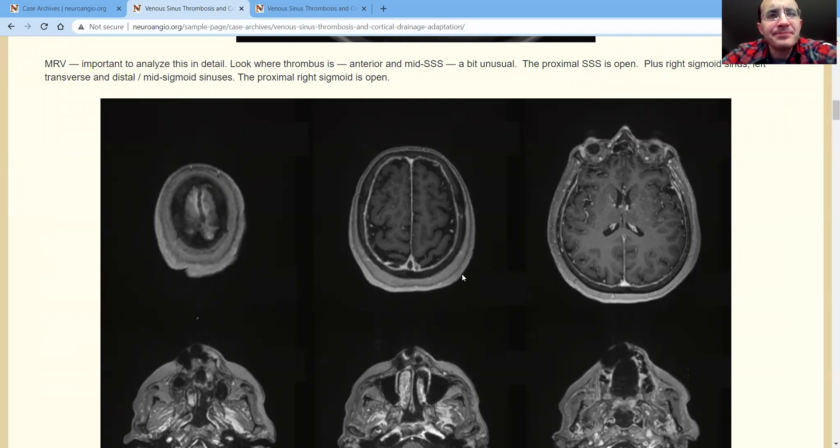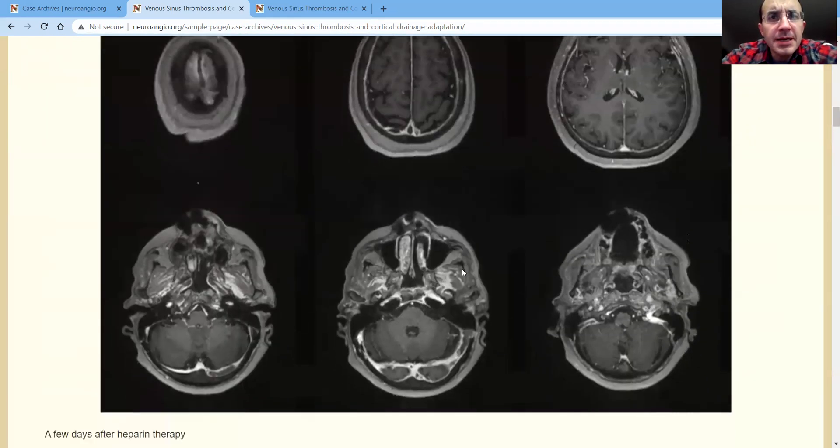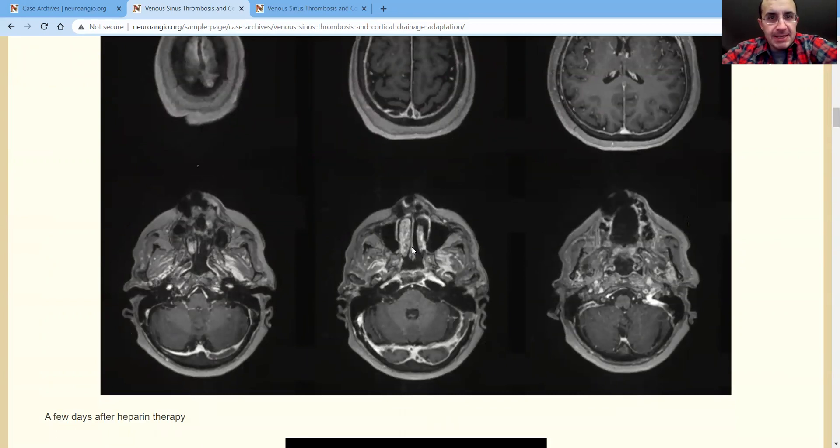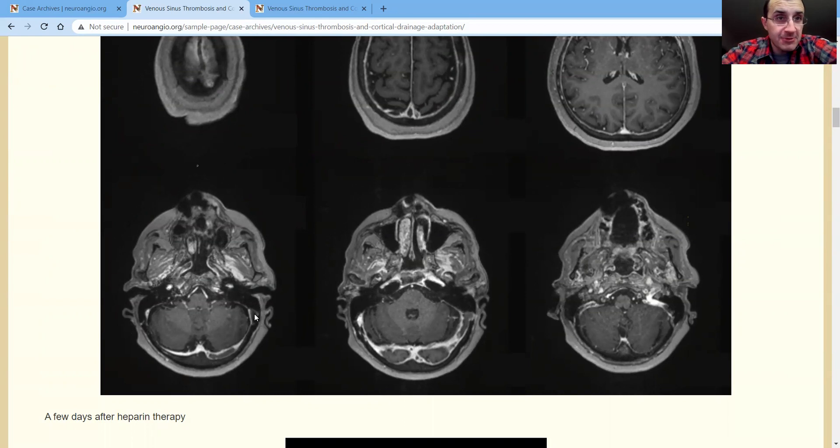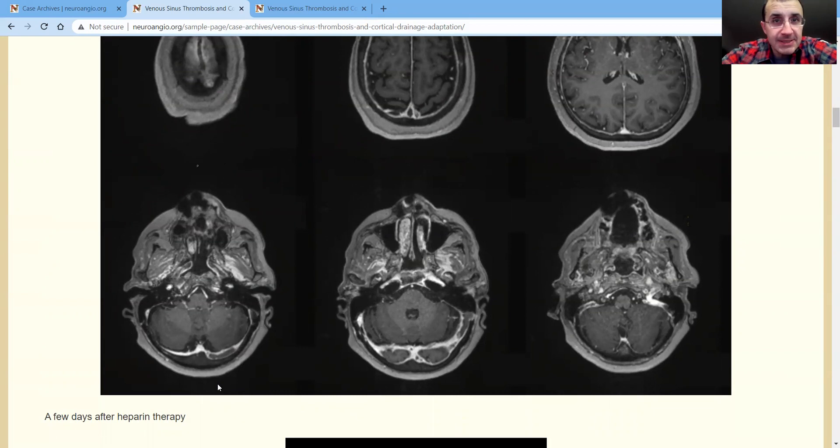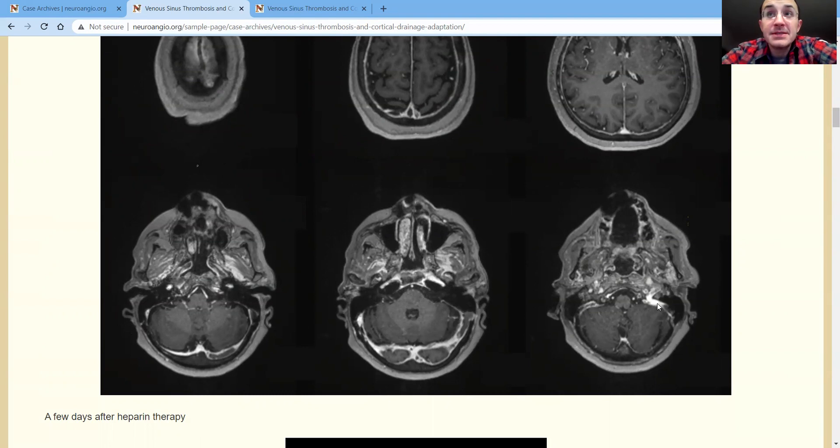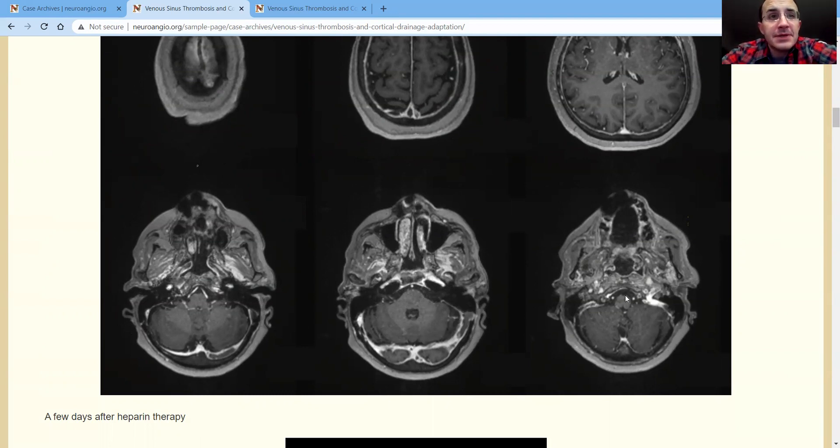Everything here is important. Now when we come down, what's going on here? So here we see the left outflow is a little bit dominant. There's a patch of clot in the transverse sinus on the left. Here's a diverticulum, and that's filled with clot too. And sigmoid sinus, a lot of clot in there. Very proximally on the left, the sigmoid is open. So pay attention to that.